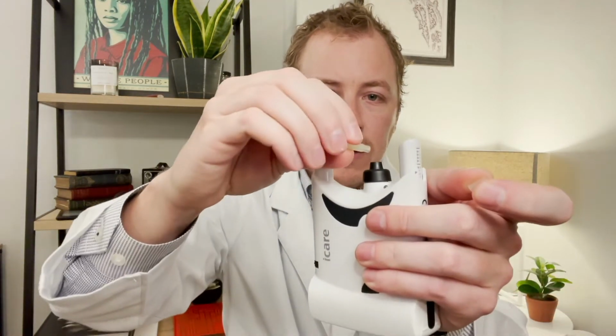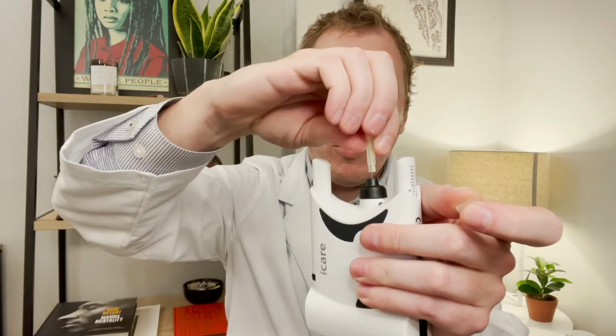So let me show you what that looks like. We've got one probe here that's open. And actually we'll turn the device on first. So we turn that on here, hold down the power button for just a couple seconds. It tells us to load, and we take a probe, which I had already opened out of the package, and we kind of pour that down into the probe. And then we click the top button before we turn it over, and that will magnetize this so that it can't fall out.